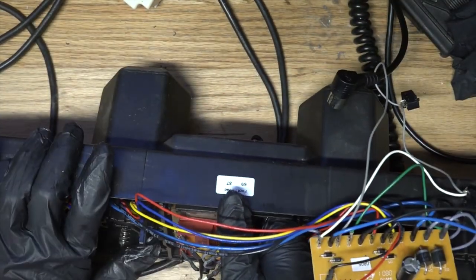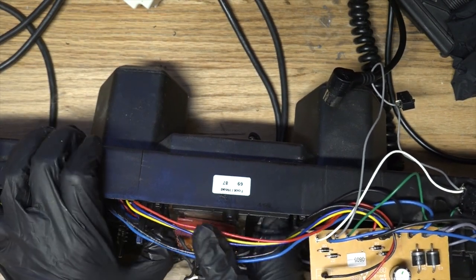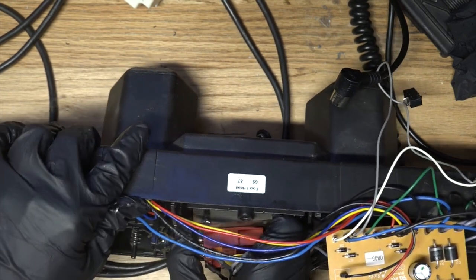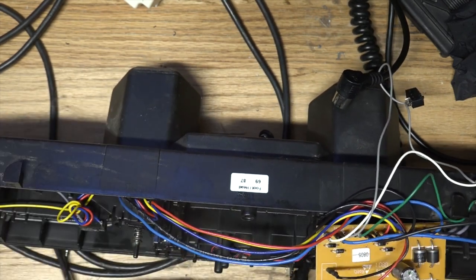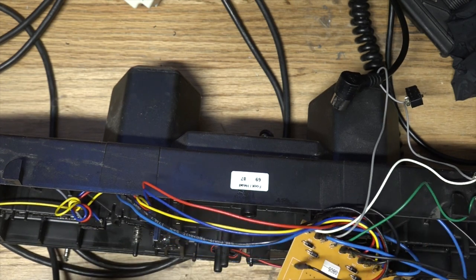Yeah, it just fits snugly in there. It's not even the screws that are holding it in, I don't think. I think it's just holding the cover on the other side. There we go. Could be wrong. Maybe I lied. So there it is. Interesting.